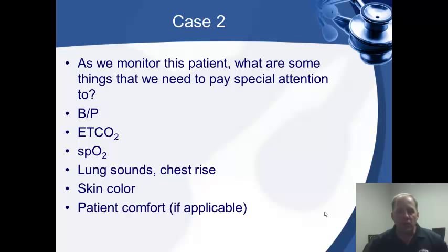Don't forget to listen to your lungs on your patient, because that is the most important thing, is paying attention to your patient. Listen to lung sounds, make sure they're bilaterally clear, we don't have any obstructions, and make sure that both lungs are inflated. Watch their skin color, make sure they're good and pink, and make sure the patient's comfortable. You may have a patient that starts to buck the vent or overbreathe the vent. A little bit of this is okay. If they start to do it a lot and start to move around, consider sedation with Versed and fentanyl.